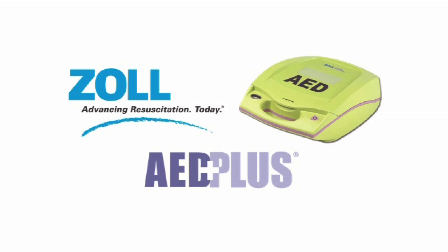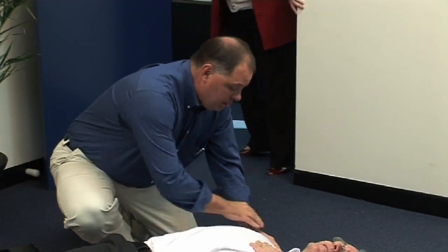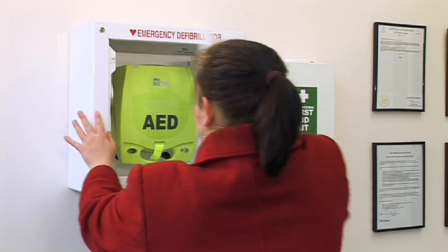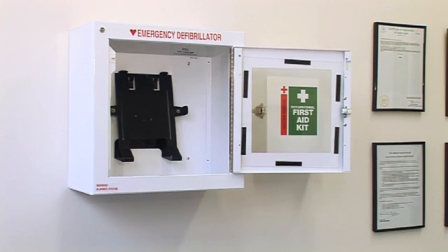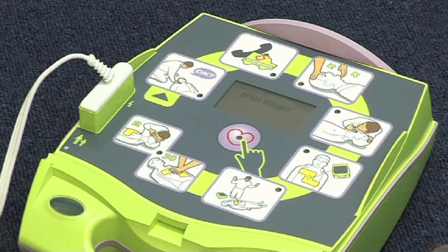The Zoll AED Plus provides a step-by-step process to help you provide life-saving care during sudden cardiac arrests. During a sudden cardiac arrest, every second counts, so your understanding of the following procedures can save someone's life. The AED Plus unit provides voice prompts, text information and visual indicators to help you perform the correct action at the right time.